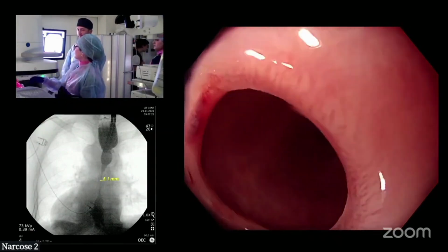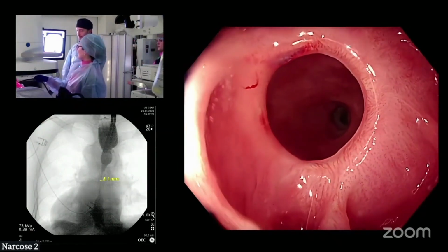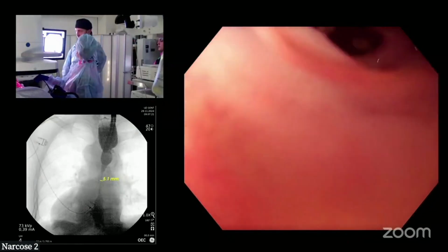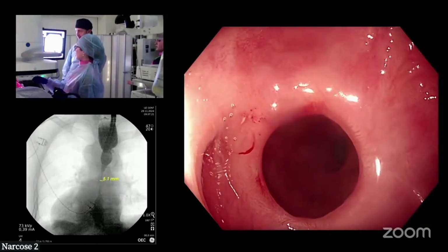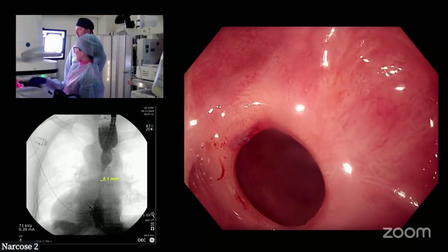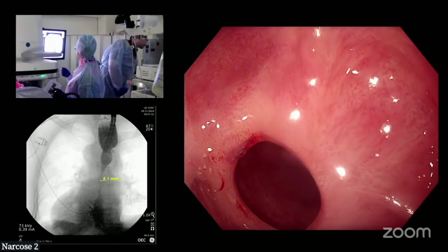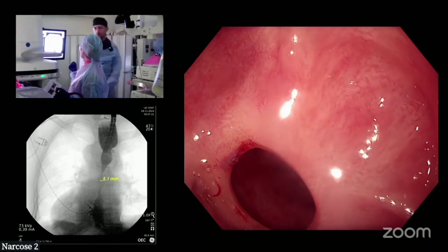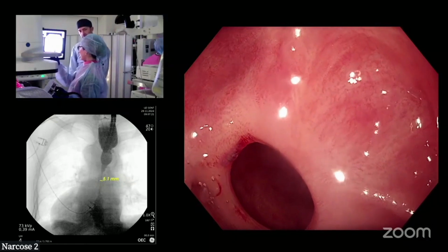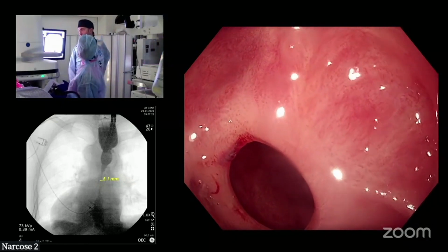Well, the previous one was 12, right, but this is like smaller than 12. Seems like smaller. I mean, since the story and the symptoms of the patient, which now has for 10 days, it was okay, and now it's still eating some liquid. I would go. I was actually before thinking to use the 12-15 balloon. Okay, that's what I would do. I agree.